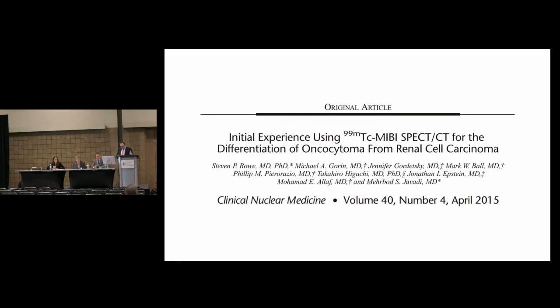So we looked in the literature to see if anyone had ever thought of this concept before, and it turns out there was one case report where someone had administered Sestamibi to successfully image an oncocytoma. This was done in the 90s, though, with planar SPECT imaging. So we thought that we were perhaps onto something, especially given the mechanism, but we really had to test this going forward using modern molecular imaging tools.